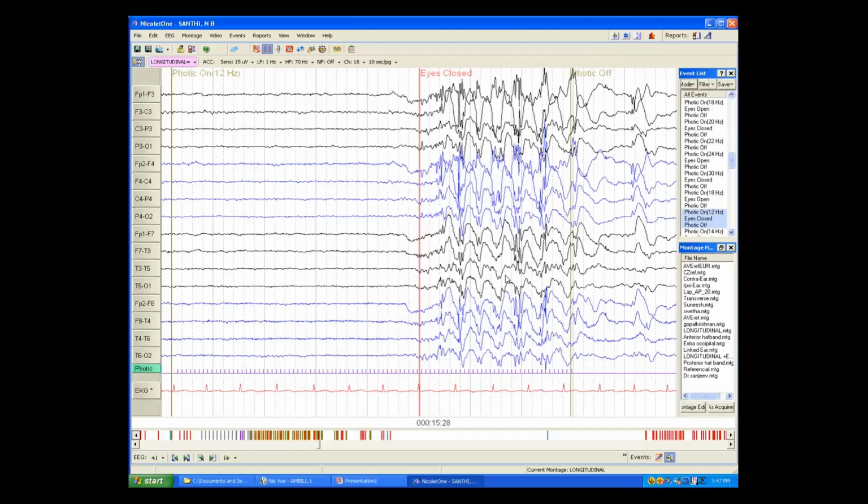Or we can also say, because these things can be traits. What is a trait? An EEG trait means a normal person who is a relative of a patient with JME can also have this EEG abnormality. But the person who has active seizures might have these discharges which last beyond the stimulus. For a person who does not have epilepsy or has only traits, the abnormal photic response will stop with the stimulus. As you can see here, with the stimulus, the abnormality stops and doesn't outrun the stimulus.